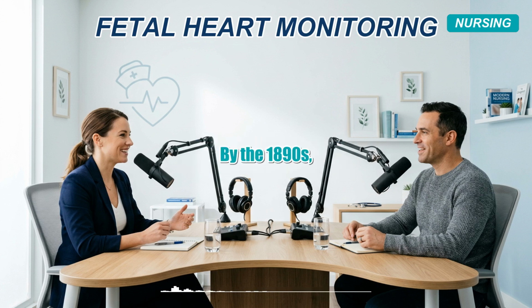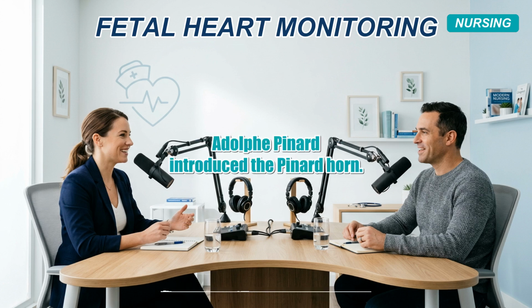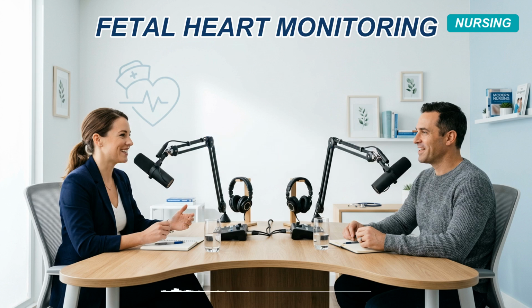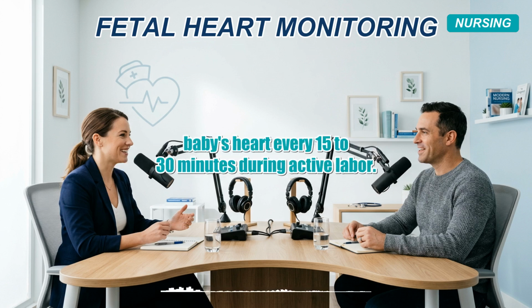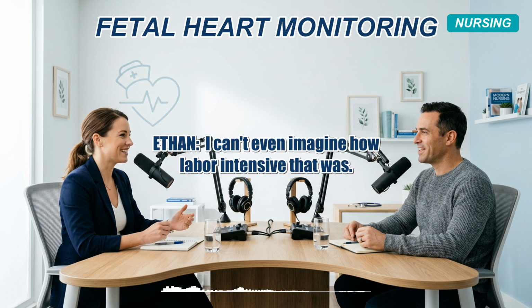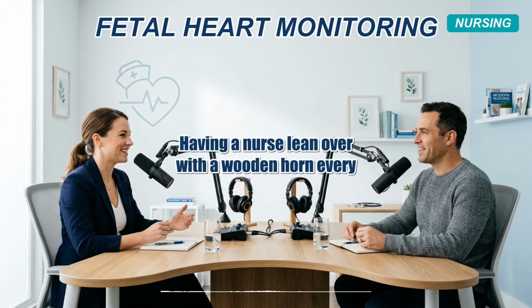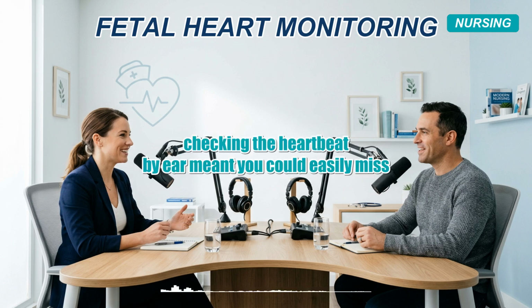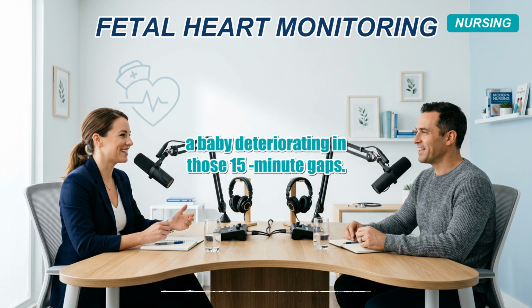By the 1890s, Adolphe Pinard introduced the Pinard horn. Which was essentially a specialized trumpet-shaped fetal stethoscope, right? Exactly. Doctors and midwives would use it to listen to the baby's heart every 15 to 30 minutes during active labor. I can't even imagine how labor-intensive that was, having a nurse lean over with a wooden horn every 15 minutes for hours on end. And checking the heartbeat by ear meant you could easily miss a baby deteriorating in those 15-minute gaps.